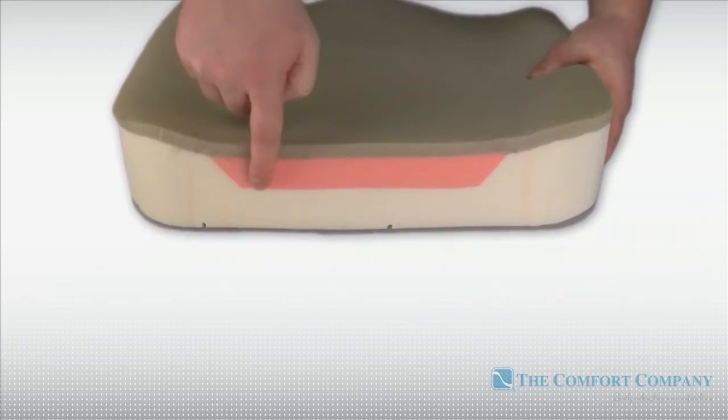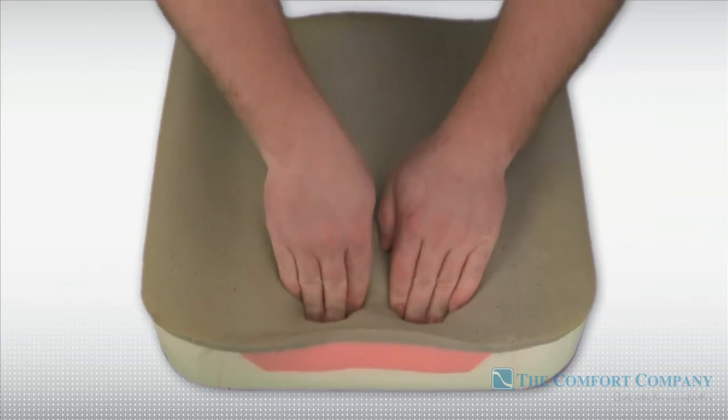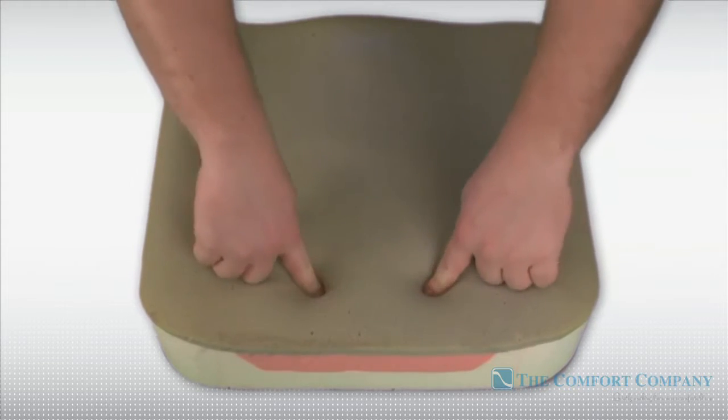The Ascent also features an ischial insert made from visco memory foam, which contours to the user's body, providing maximum skin protection and extra relief for the ischial tuberosities.